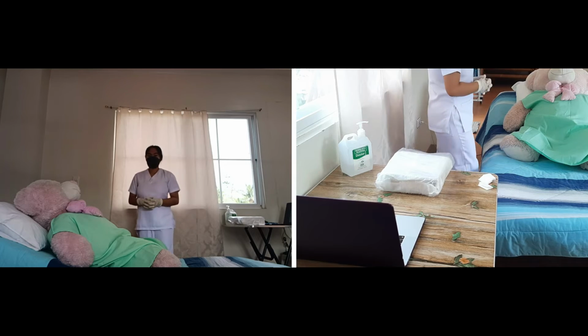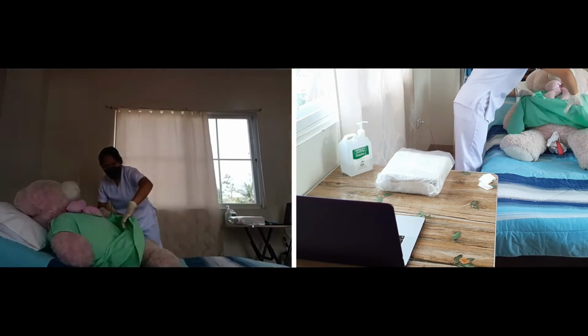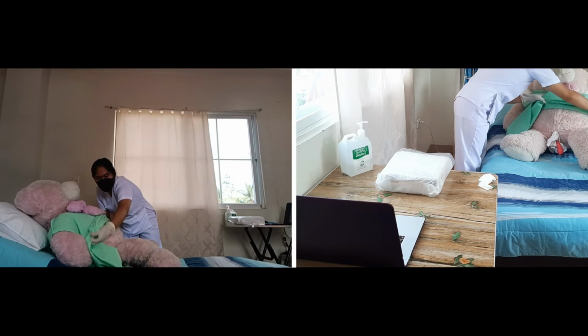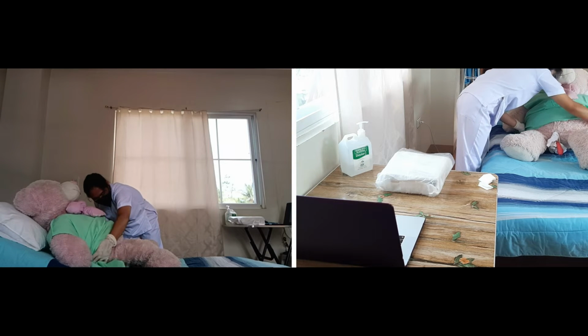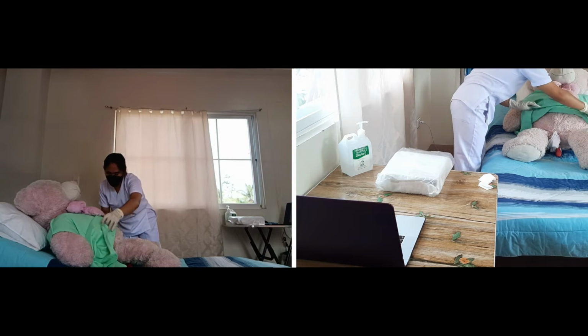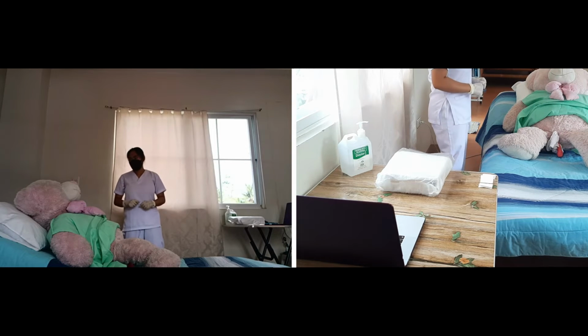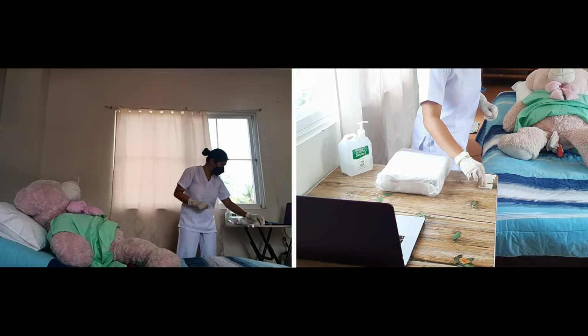So now it is time to position our patient in a dorsal recumbent position. Okay, so Mr. Park, let me clean your perineal area.